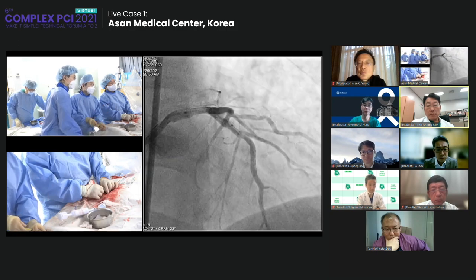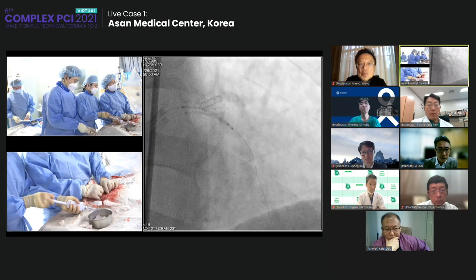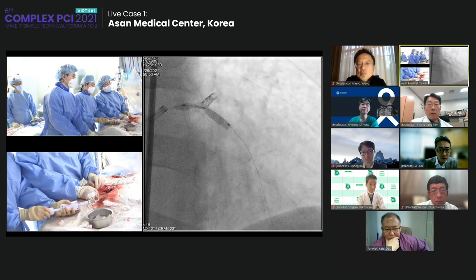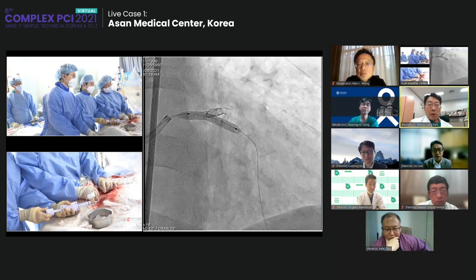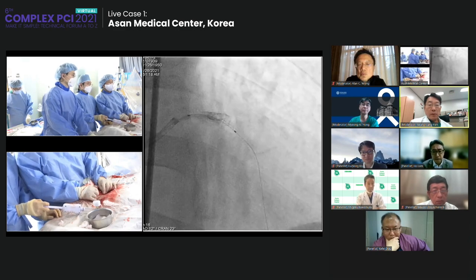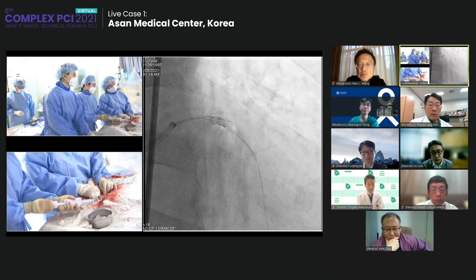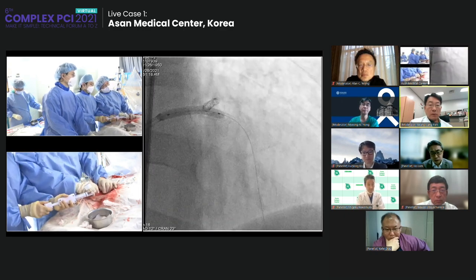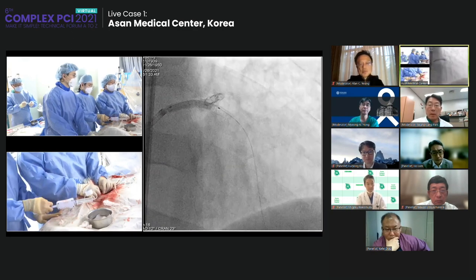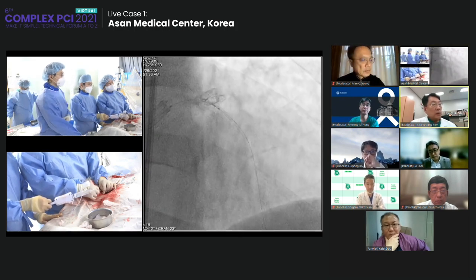Test. Okay. Great. Ready? Inflation. 6. 8. 10. Stent size is big enough, right? 4.5, almost 5. 12. 14. 16. 18. Deflation. 4.3. 4.5 high pressure balloon, please. 18? Yes. What size is the final balloon diameter?